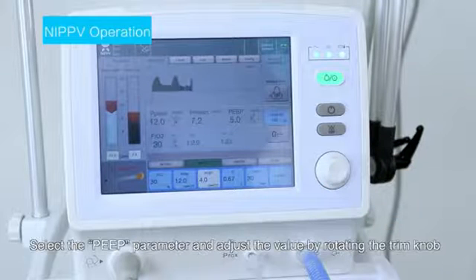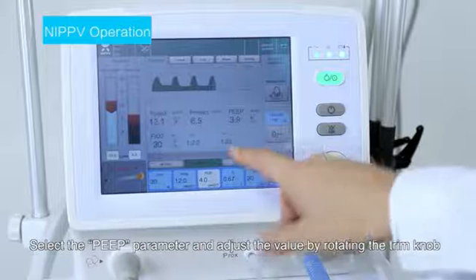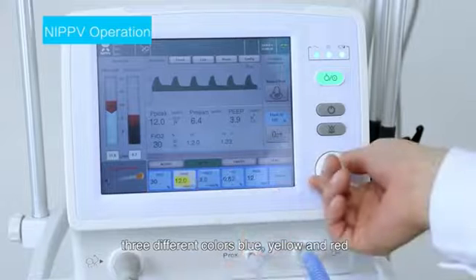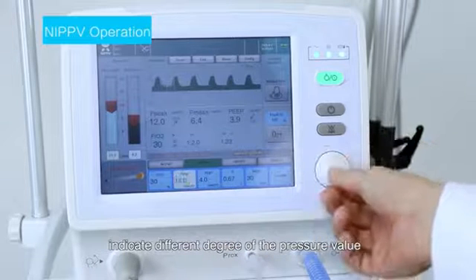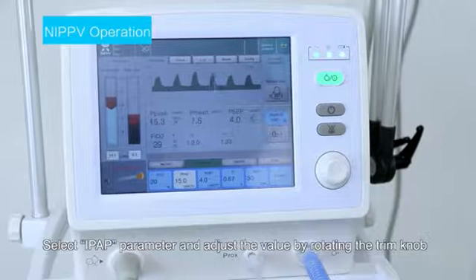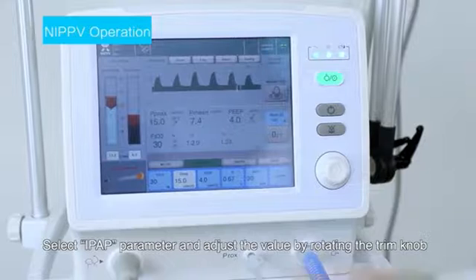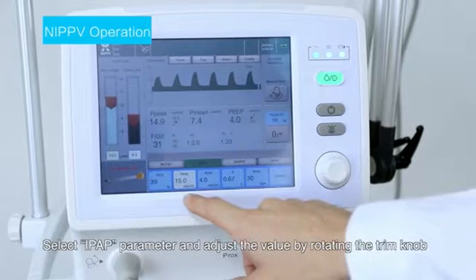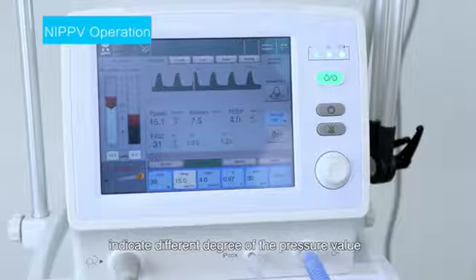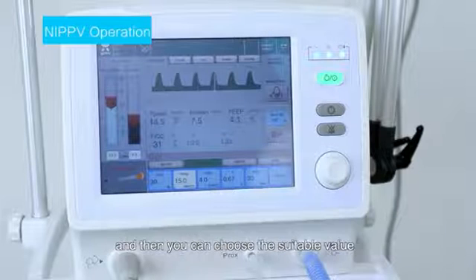Select the PEEP parameter and adjust the value by rotating the trim knob. 3 different colors, blue, yellow and red, indicate different degree of pressure value, and then you can choose the suitable value. Select IPAP parameter and adjust the value by rotating the trim knob. 3 different colors, blue, yellow and red, indicate different degree of pressure value, and then you can choose the suitable value.